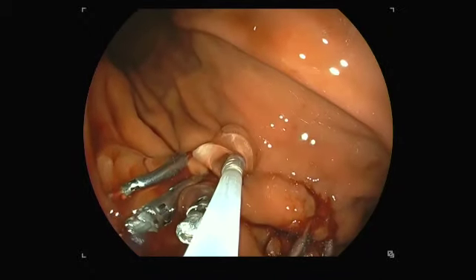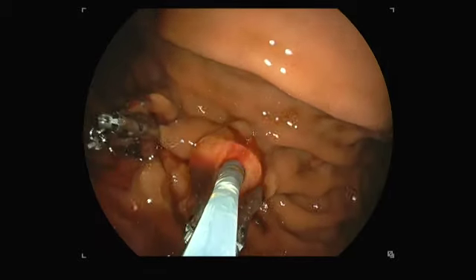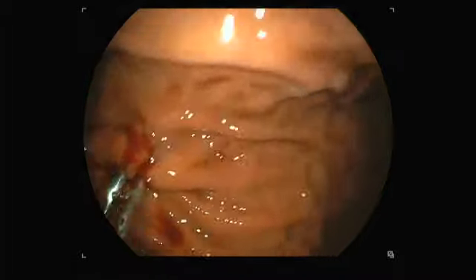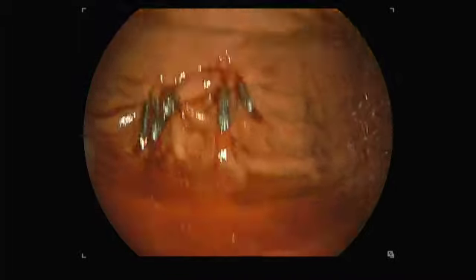So, important message: when you see somebody like this with low platelets and low white cell count, have a multidisciplinary discussion, work with the oncologist, and then consider endoscopic therapy.